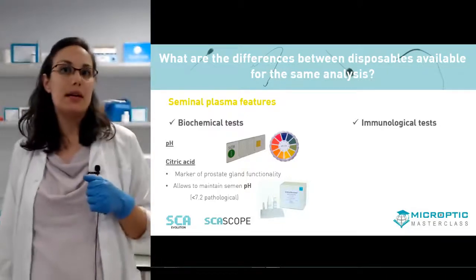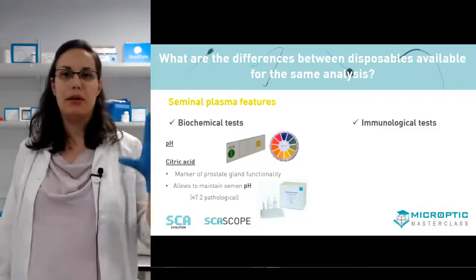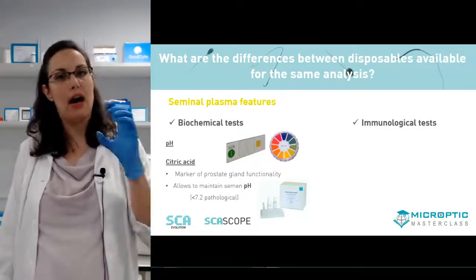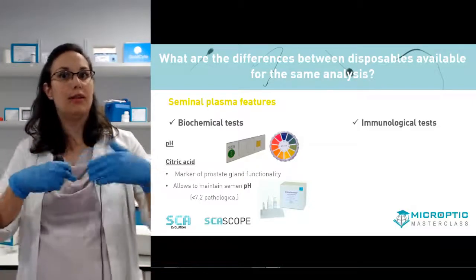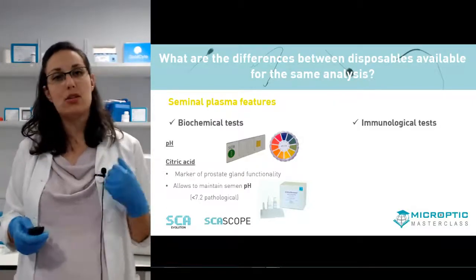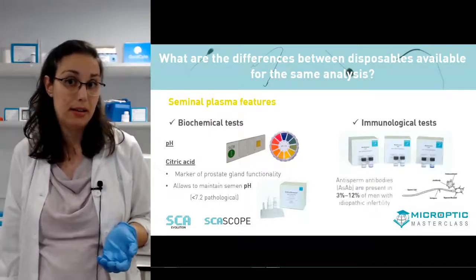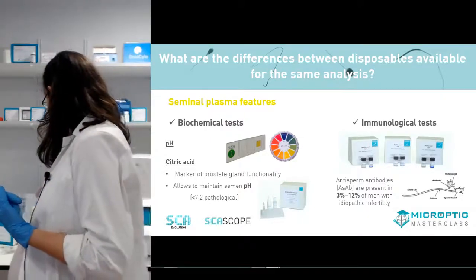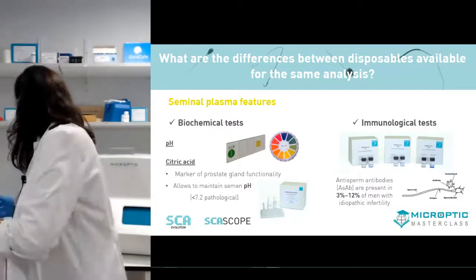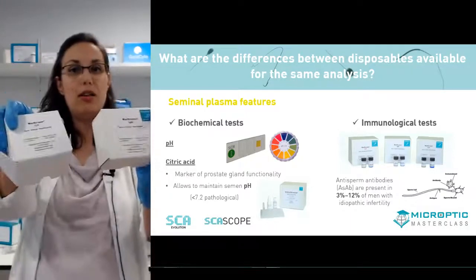In case we are observing the sample under the microscope and we detect a lot of agglutinates, lots of sperm that are attached to each other but are still moving, it could be interesting to also perform some immunological tests, like the MAR Screen test. You can find this type of kit for different antibodies.